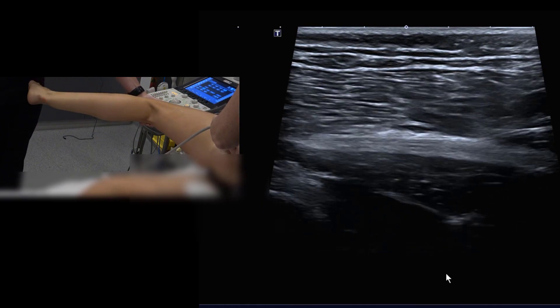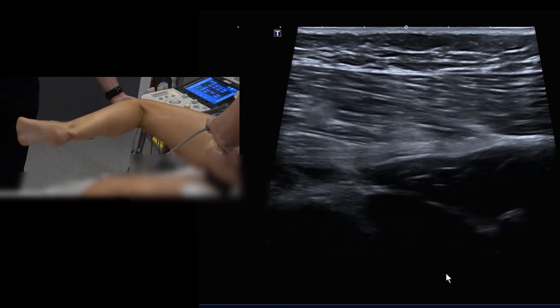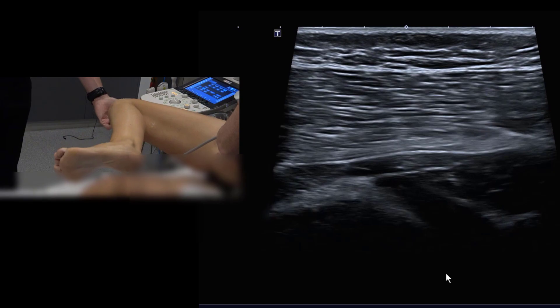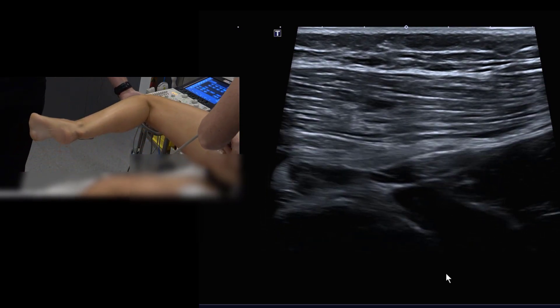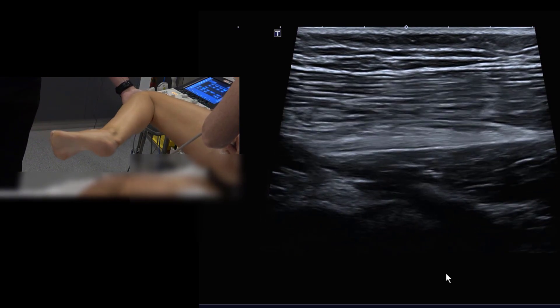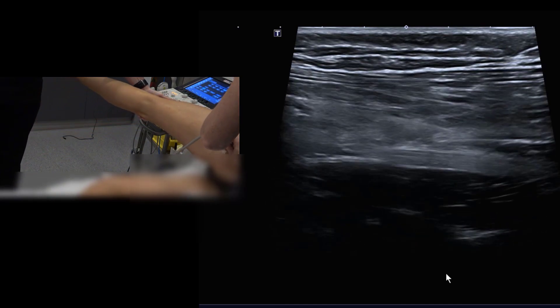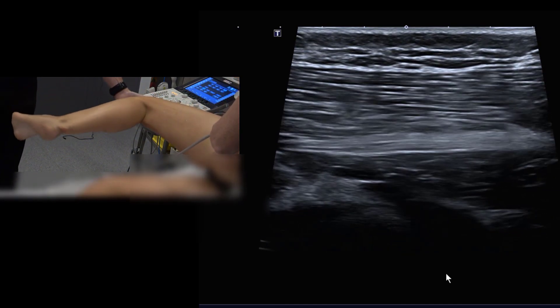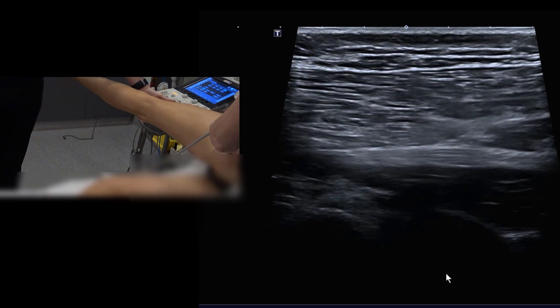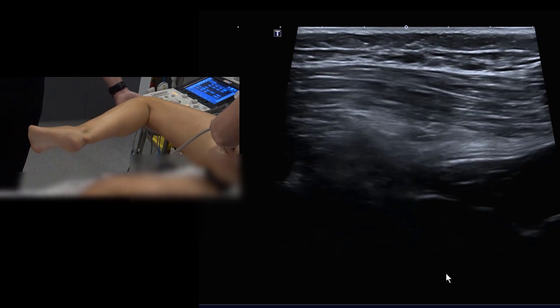Perform the movement three times: bend the knee, bring the hip back down, and repeat. Normal excursion of the nerve can be up to about 22 millimeters. Dorsiflexing alone or just moving the lower leg with the hip fixed won't produce maximal excursion. It's essential to start from hip extension, move toward the abdomen, then kick out the lower leg with dorsiflexion to achieve full sciatic nerve excursion.